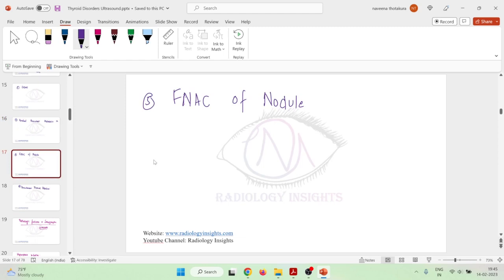Then we can do FNAC under ultrasound guidance. Ultrasound guided FNAC is one of the best techniques to get an adequate sample for fine needle aspiration cytology.